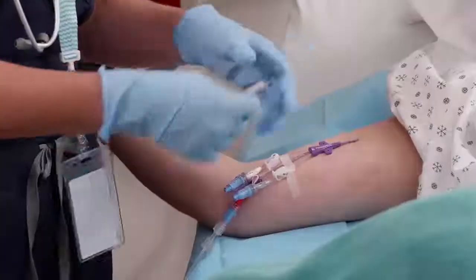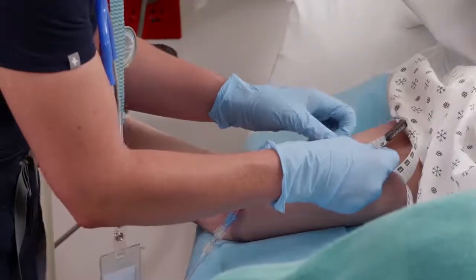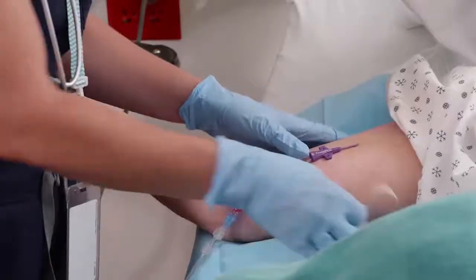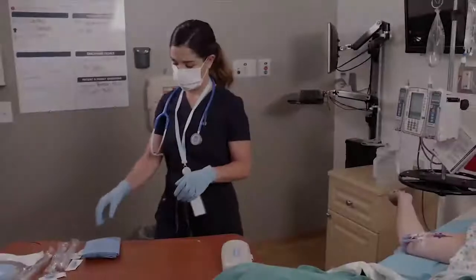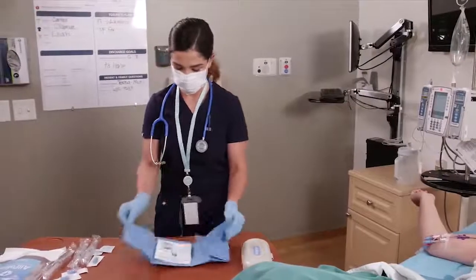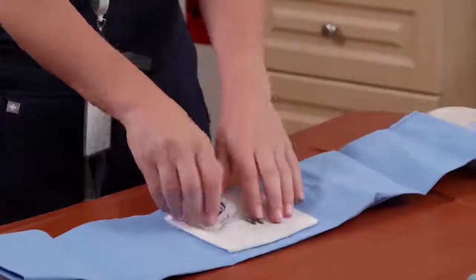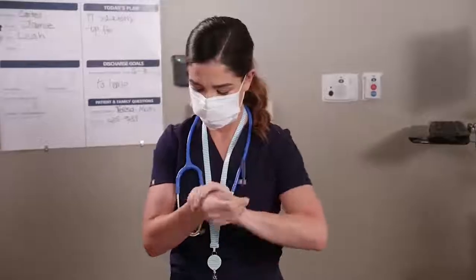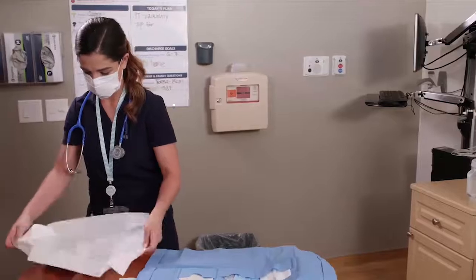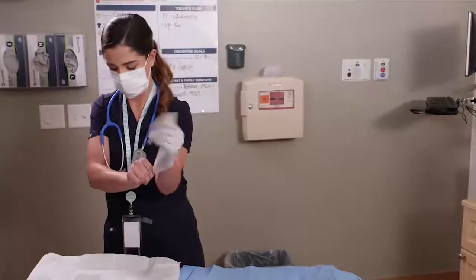Don't forget to look at the catheter and assess for changes in external catheter length. Refer to insertion documentation regarding external catheter length. Discard used supplies in appropriate containers. Change your gloves. Repeat hand hygiene. And don sterile gloves. Use care when donning sterile gloves to not inadvertently cause contamination.